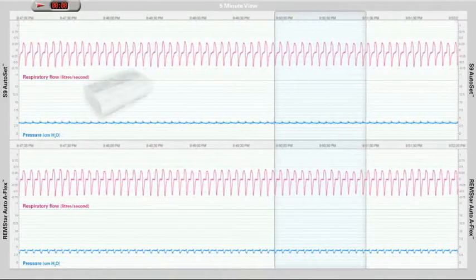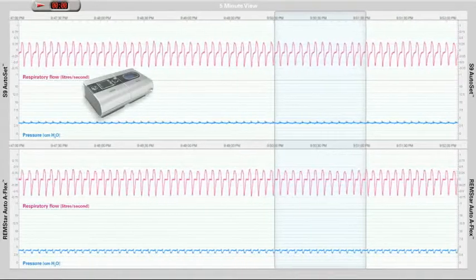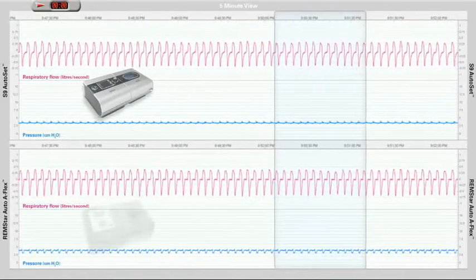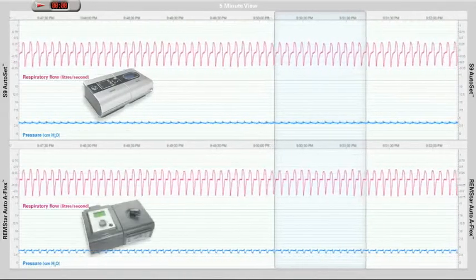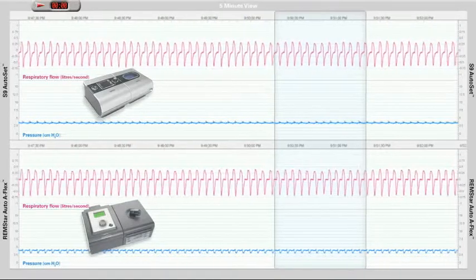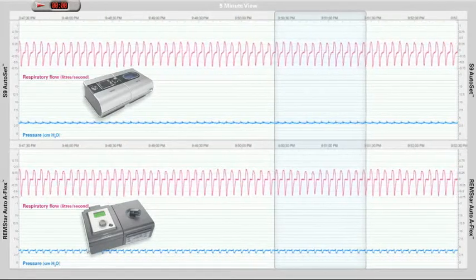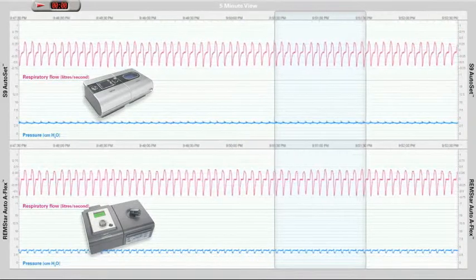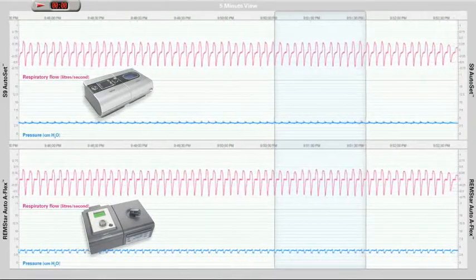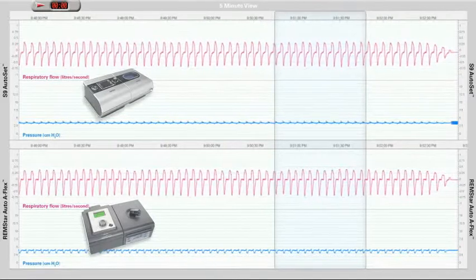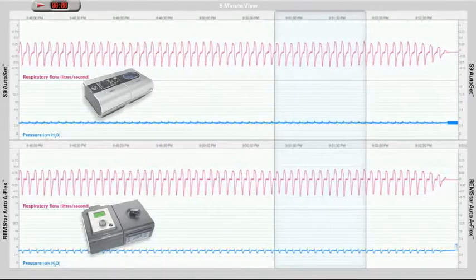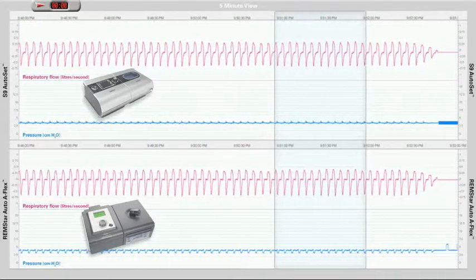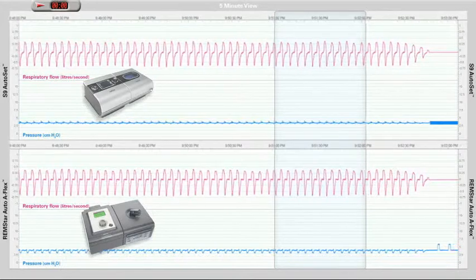The devices tested are ResMed's S9 Autoset device and the Philips Respironics Sleep Therapy System, the Remstar Auto APAP device. Each device is set to its lowest minimum pressure, highest maximum pressure, and maximum comfort setting, which is 3 for both devices.